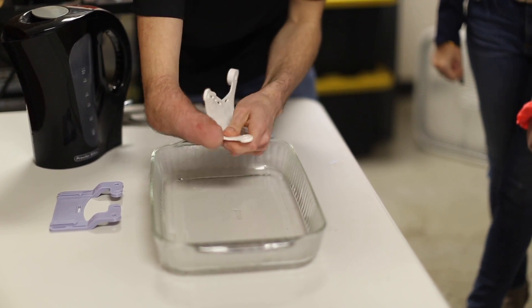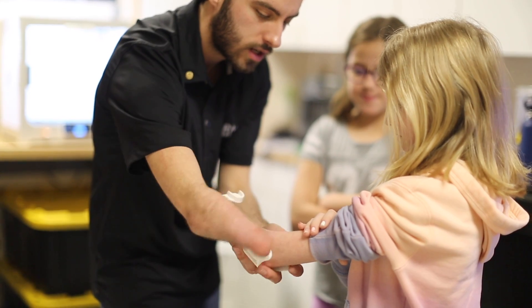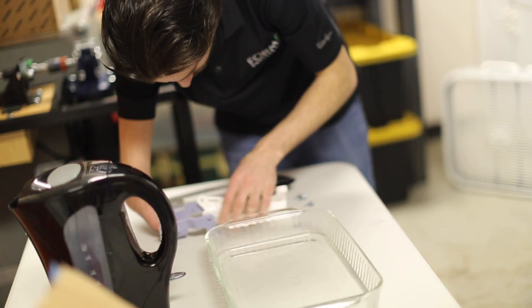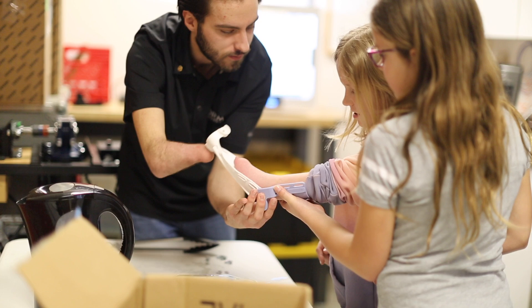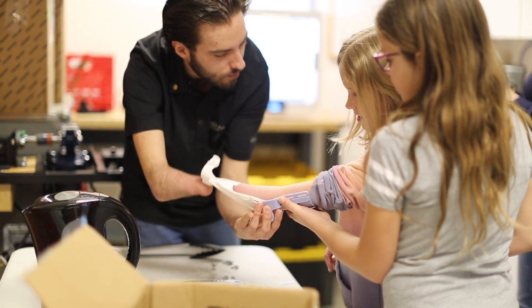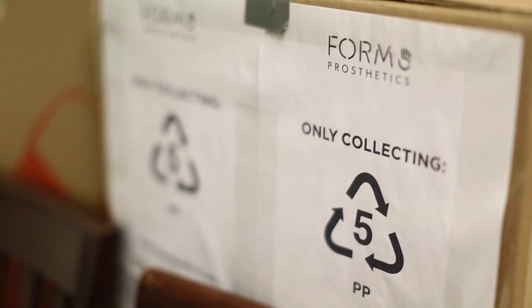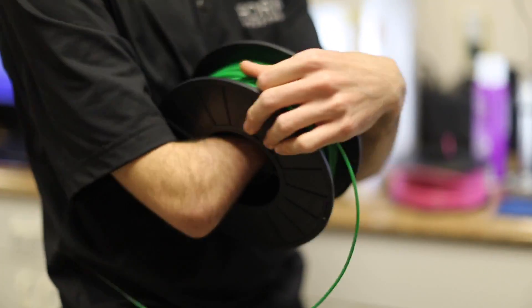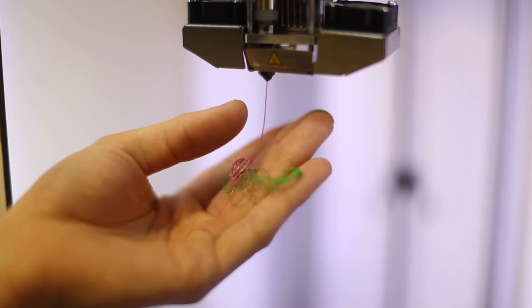One of the biggest barriers for the limb-difference community is cost. How can we manufacture and produce these prosthetics at a low cost so we can give them away to people who need them? Something we're very big on is recycling — taking plastics directly from the community that would ultimately end up in the landfill and recycling them into material for our 3D printers.